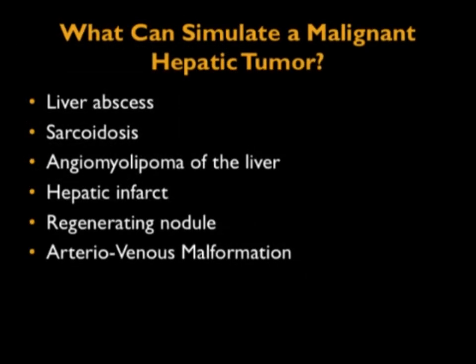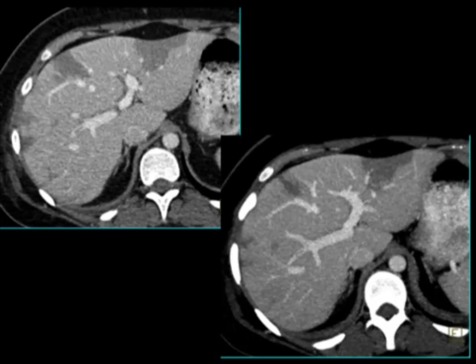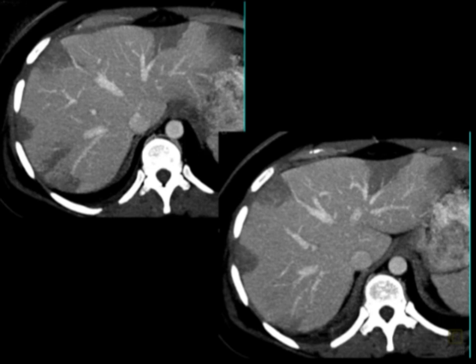Let's change topic. One of the things I always find challenging is lesions that can mimic pathology. Are there non-malignant entities that can simulate a malignant hepatic tumor? The answer is yes: liver abscess, sarcoidosis with multiple nodules, angiomyolipoma of the liver, theoretically infarcts, regenerating nodules, and AV malformations. Looking at infarcts — the liver has two blood supplies, but here's a great example of hepatic infarcts. Most commonly we see them post liver transplant surgery, but you can see infarcts from a number of causes, particularly in patients who are showering emboli. Beautiful example of different wedge-shaped defects, best seen in venous phase imaging, solitary or multiple.